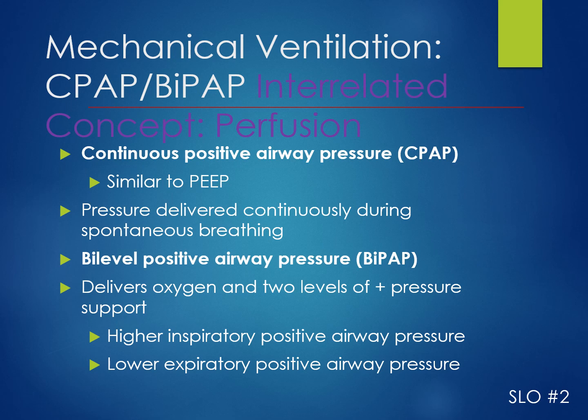Risks with CPAP and with all of the ventilator modes that we've talked about is that any increased pressure in the chest impedes venous return, because it provides mechanical constriction to those blood vessels.